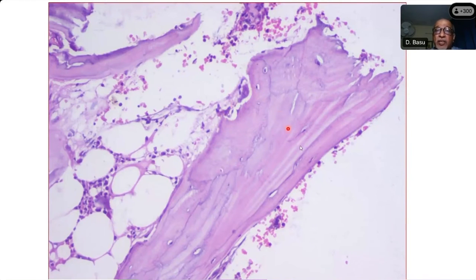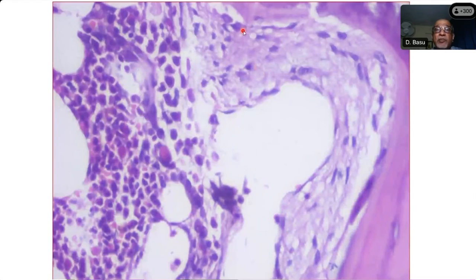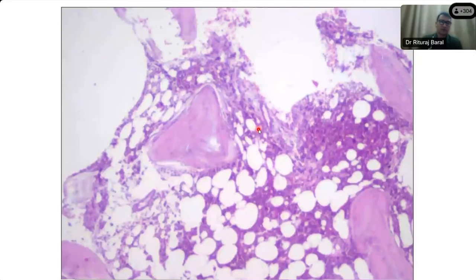And there is this osteoclastic rimming, and also this peritrabecular, paratrabecular fibrosis, and osteoblasts are lining it. So what do these things imply? These are the features of renal osteodystrophy, sir. Okay, fine, very good. This patient is a long-standing patient of renal disease on dialysis.